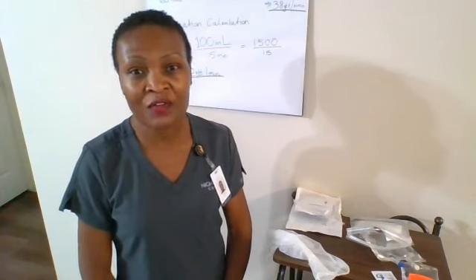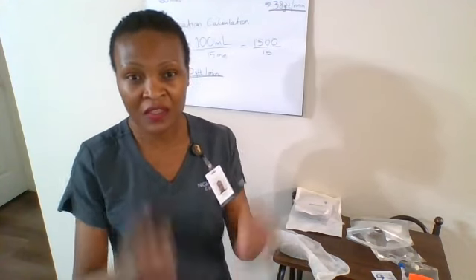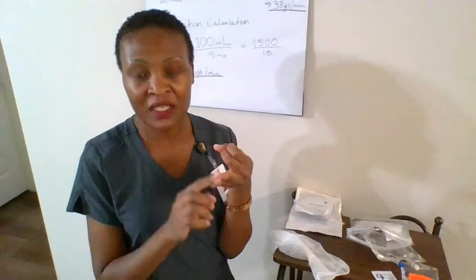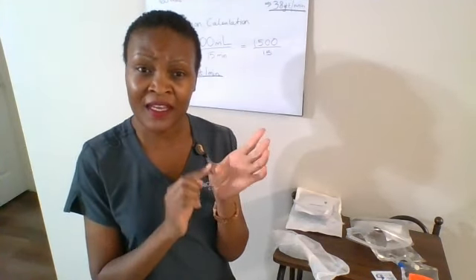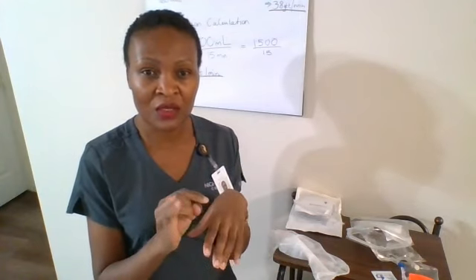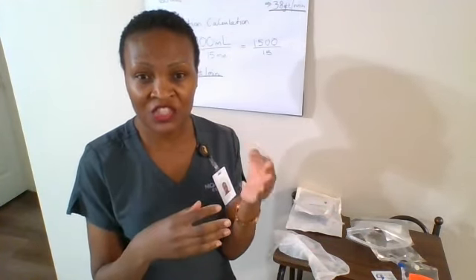We're going to perform the 6 patient rights of medication administration, making sure we have the right patient, the right medication, the right dosage, the right route, the right time, and the right documentation. Once that is done, we're going to perform 3 medication checks.